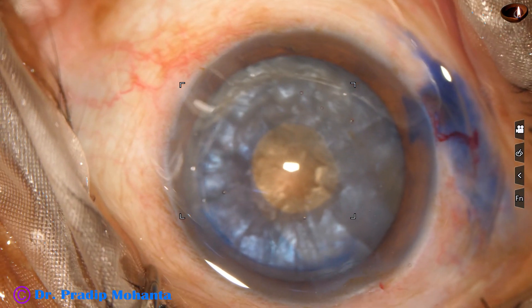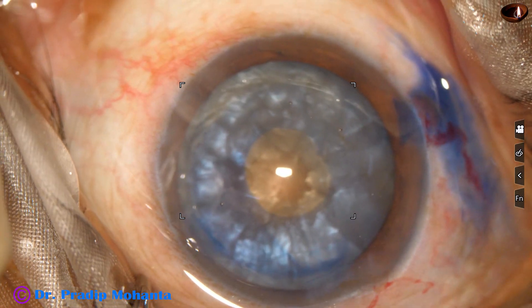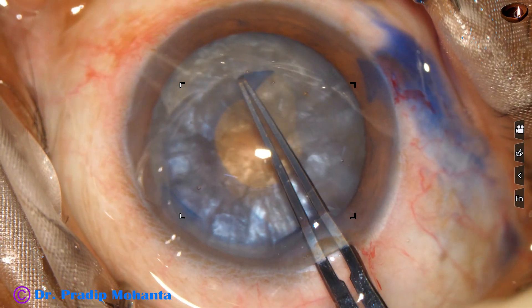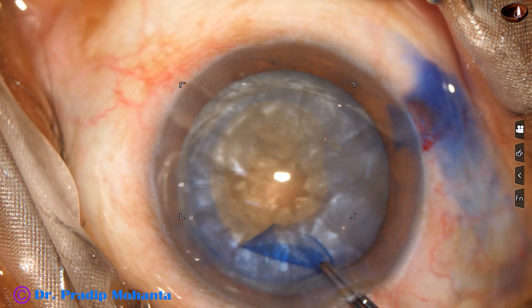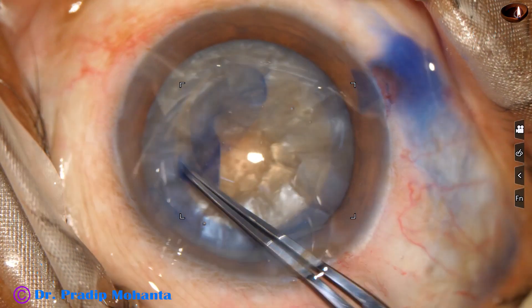Now I inject Viscoelastic. Make a small nick at the rhexis margin at around 8 o'clock. Take the Utrata forceps and enlarge this mini-rhexis into an optimum-sized rhexis.